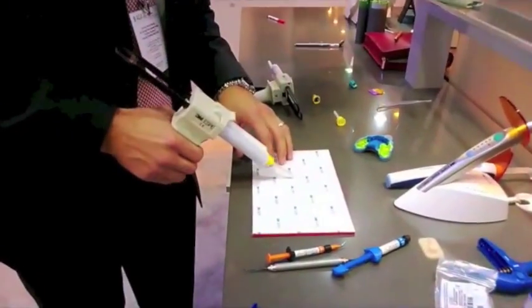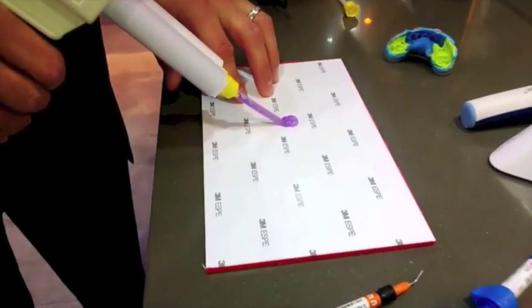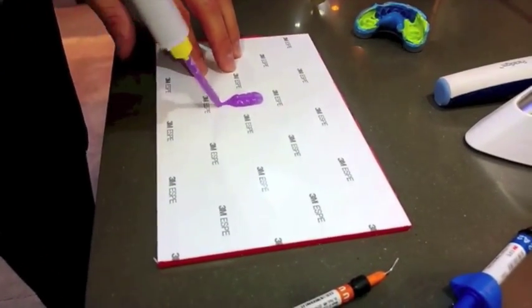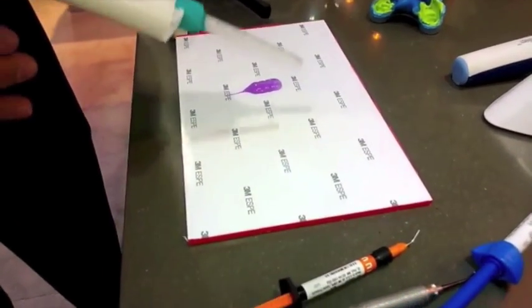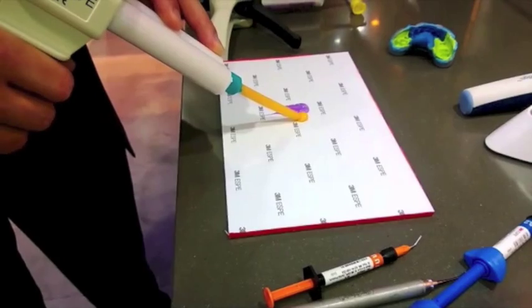We're going to show the hydrophilic properties of Imprint 4. This is Imprint 4 super quick light material that we're dispensing, and we've got a competitive material that we're going to dispense alongside it.